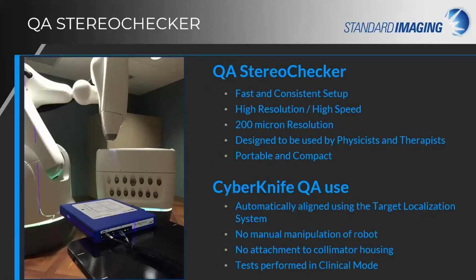So every time I hear stereotactic, whether it be SRS or SBRT, I know that it means high dose rates in one or few fractions to small targets. And I think, please, oh, please get it right for the patient's sake. It is our duty here at Standard Imaging to provide our customers with excellence in precision and accuracy so that they can confidently treat patients safely.